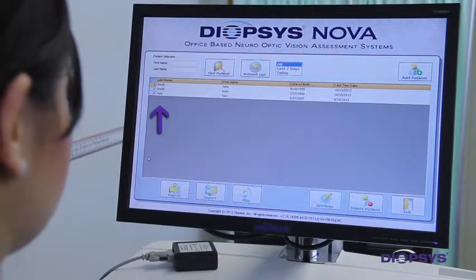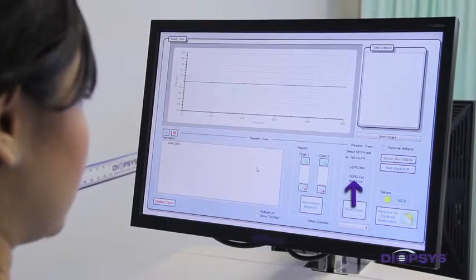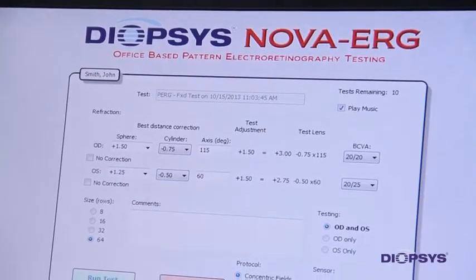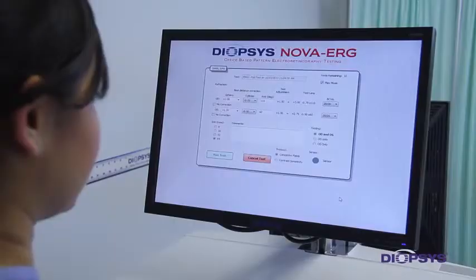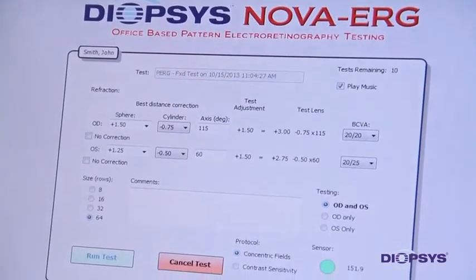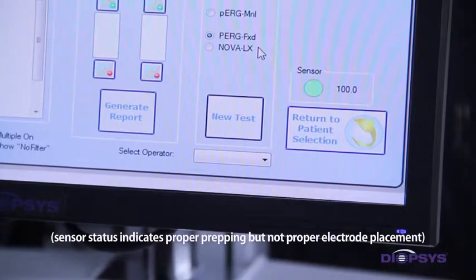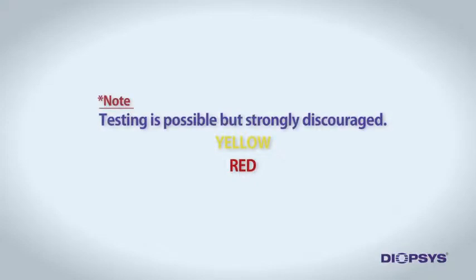Double-click on the patient's name to get to the Select a Test screen. Under the Select Nova Test section, select the PERG FXD option and click New Test. Depending on which test the doctor has ordered, click on Concentric Fields or Contrast Sensitivity. Notice the sensor status indicator shown on the testing screen. This sensor status is a measure of the quality of the connection to the patient's head through the electrodes. The sensor has three status levels from best to worst: green, yellow, and red. If the sensor status is not green, testing is possible but strongly discouraged since the reliability of the results may be greatly affected.